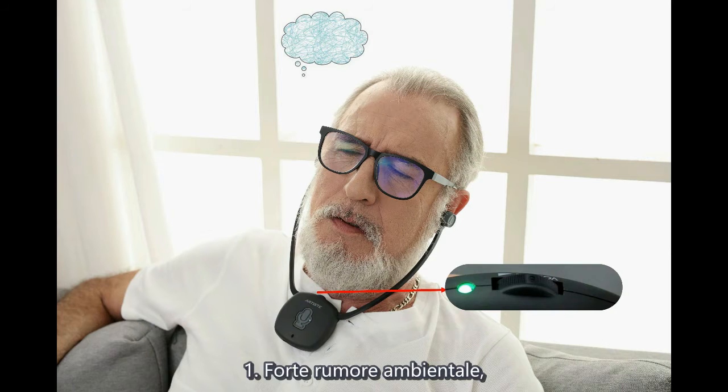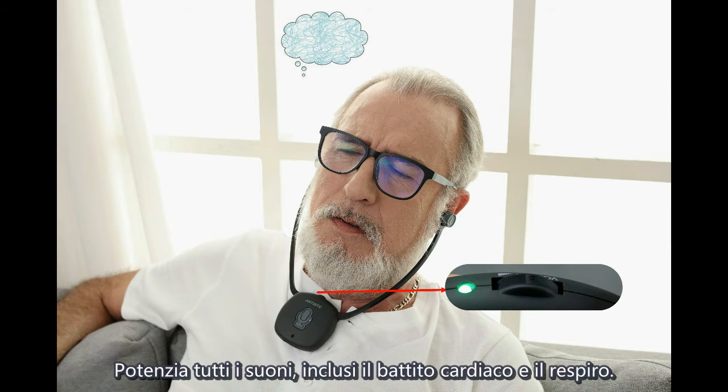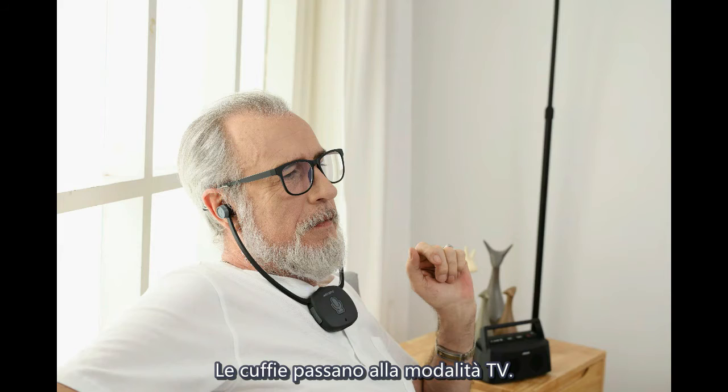Troubleshooting. If surrounding sounds are too loud — even hearing your own heartbeat — check the headphone's LED light. If it is green, it is in hearing aid mode, which amplifies all sounds including your heartbeat and breath. Please press the microphone button once. The LED changes to blue, switching the headphone to watching TV mode.